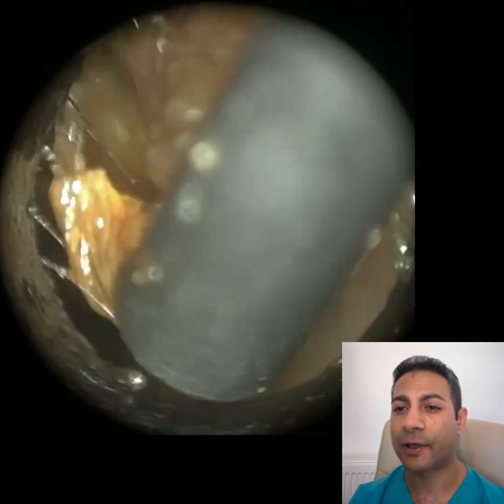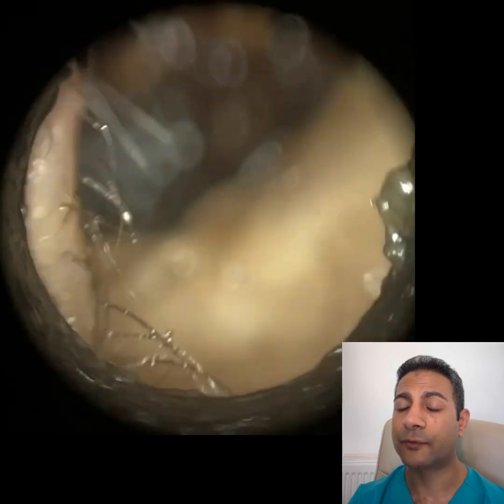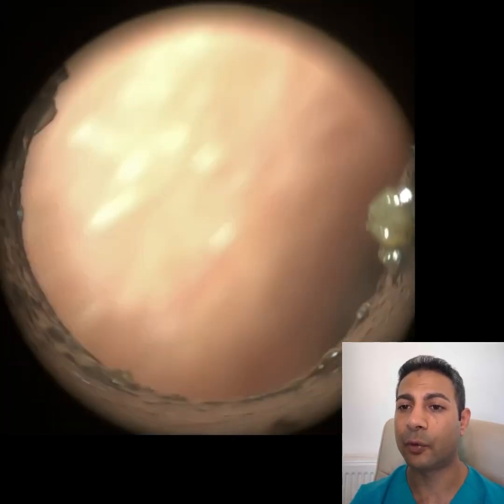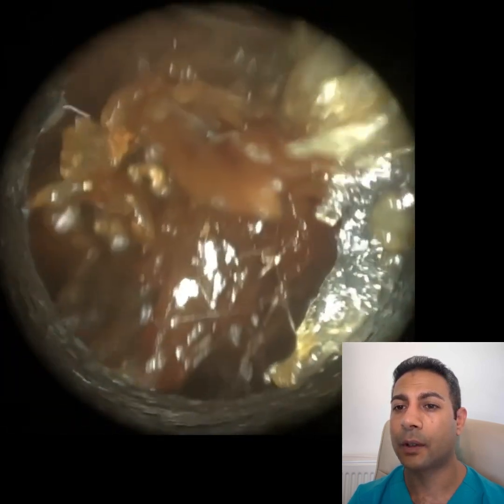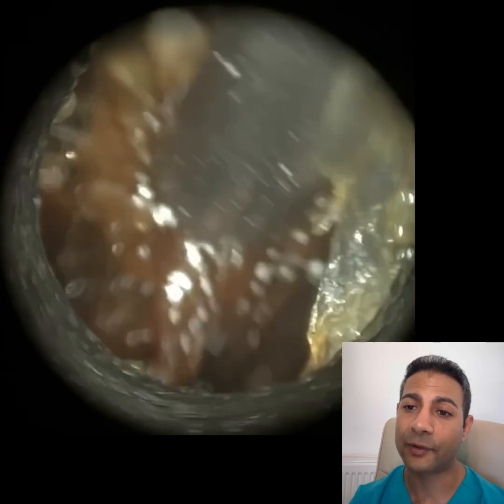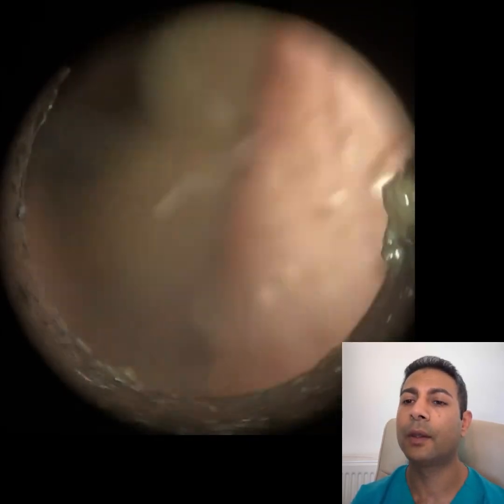So this is their right side again. Patient's been using a lot of drops. It's just this layer of skin that I'm just peeling away, and that will help to mobilize the wax plug. Now this wax looks at the entrance of the ear, but it's not. It's probably halfway into the ear canal. Because of the magnification of the WAXscope, it just looks a lot closer.